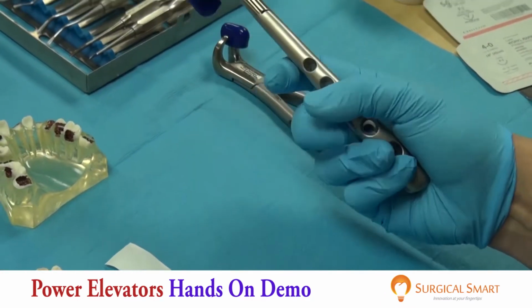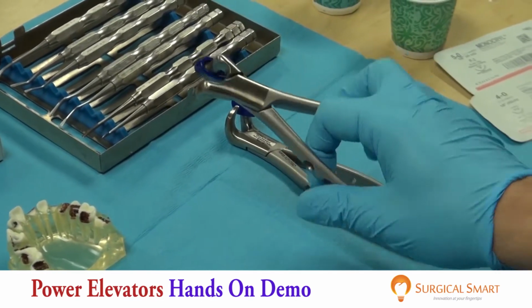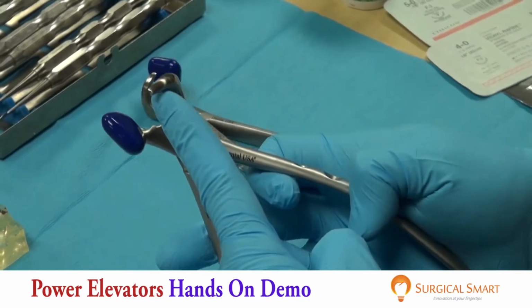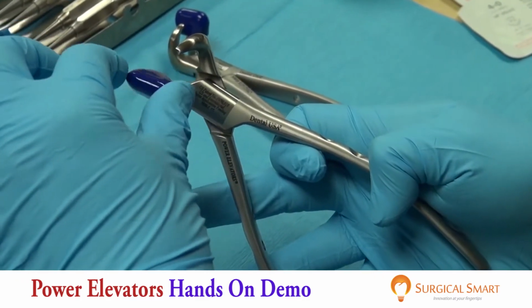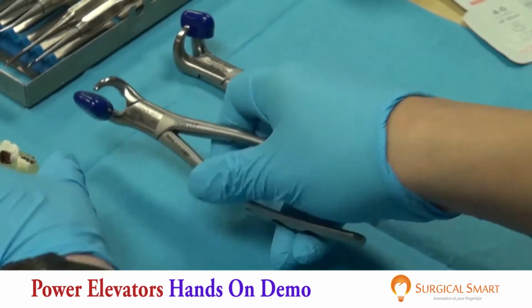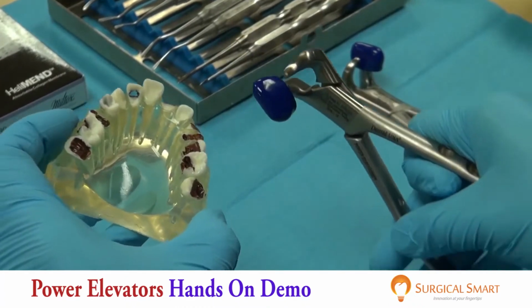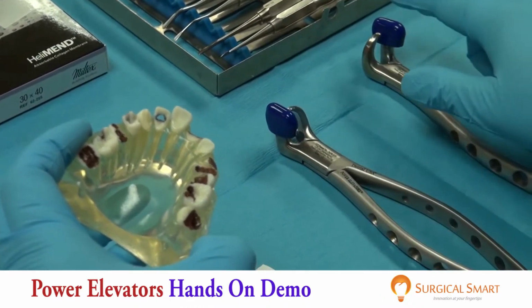Essentially, those of you who have done a lot of extractions or are familiar with extractions, you've heard of the physics forceps. This is basically a variation of the physics forceps. It has a pad and it has a leverage end. But here's the beautiful part. The pad swivels, which allows you to extract the tooth not simply from a front angle, which is the way the physics forceps work, but you can actually approach the tooth from just about any angle. There's one for the buccal end, there's one for the lingual end.